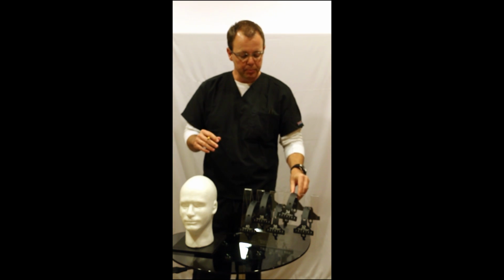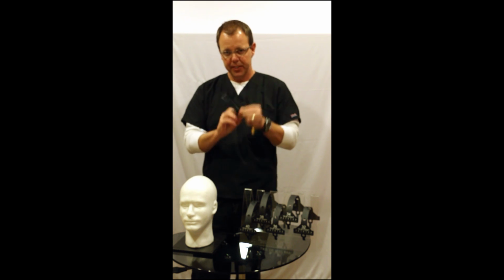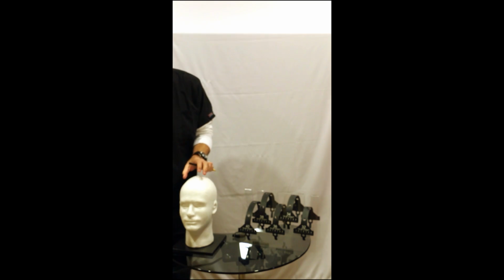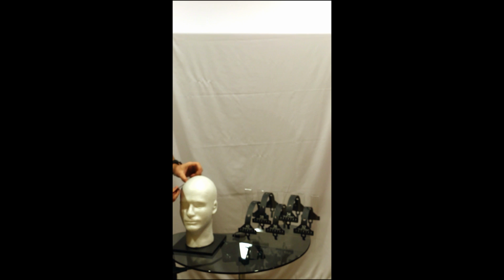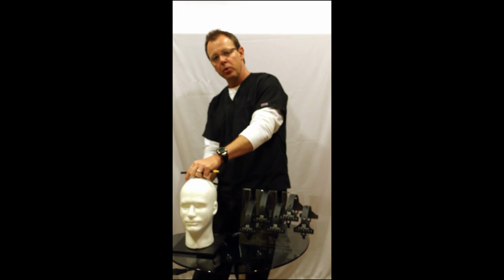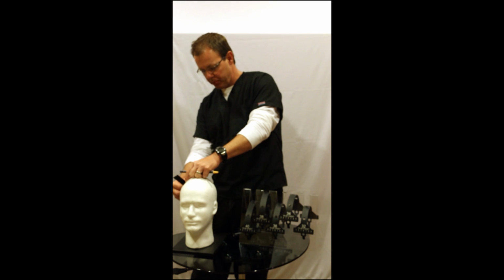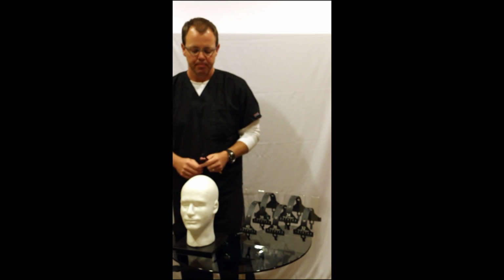So then, I put my tool back. The only thing that's left is to take my 15 centimeter ruler and actually connect the dots between my C and my FP at 50%. 50% of that is going to be where I'd mark my F's, and I do that on both sides. And I can take my C and my O's, and I can get my P at also 50% of the distance. That's all you have to do.